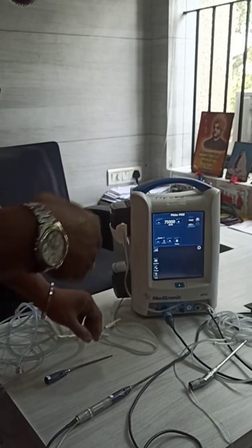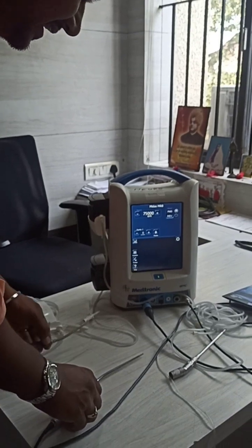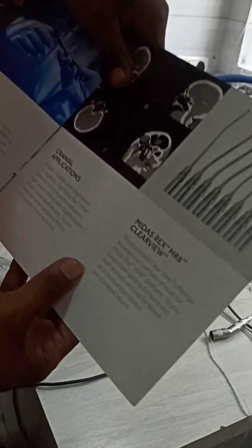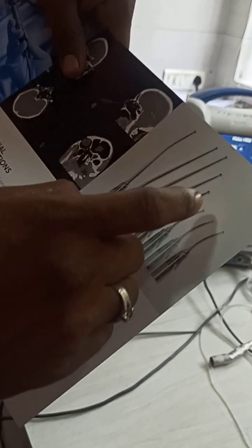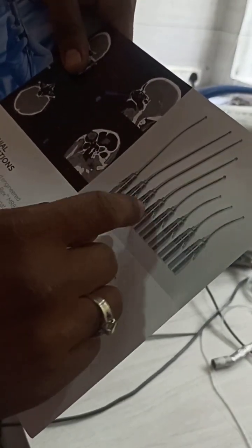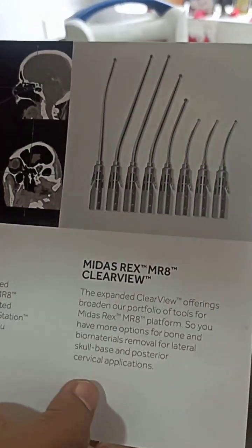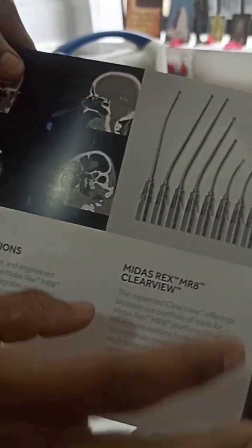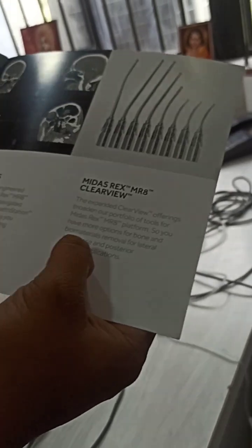When reaching the sella or skull base sphenoid procedures, it will be very helpful. Even for spine cervical procedures it is very useful. We have different sizes - not limited to just these two. You can see in this catalog: proximal bend, distal bend, different bendings, different curvatures - as per the surgeon's convenience. These are MR-8 clear view burrs mainly used for lateral skull base and cervical applications, and very useful for minimal invasive procedures.